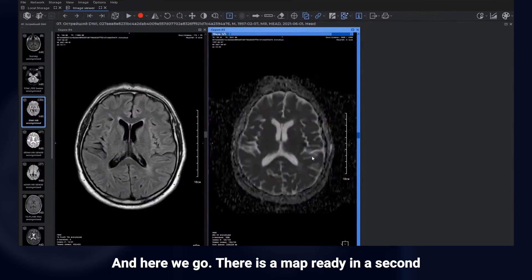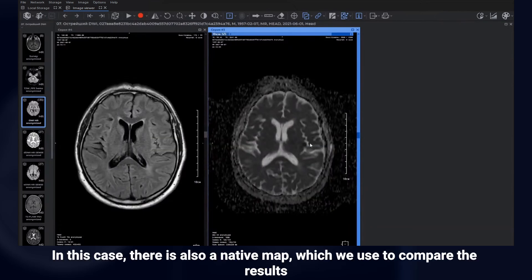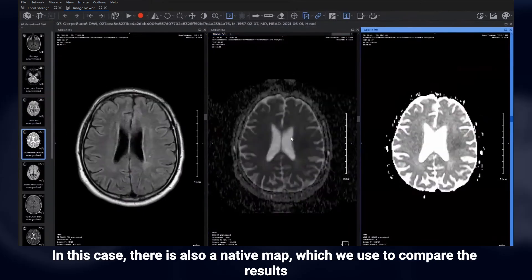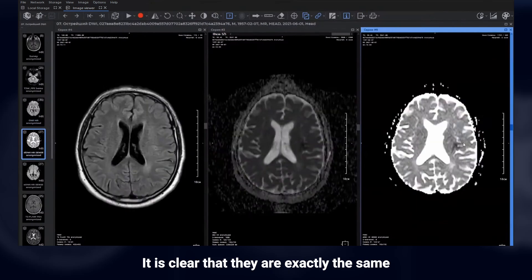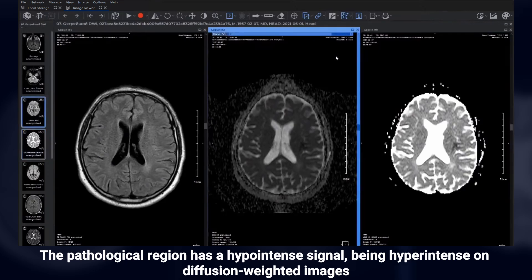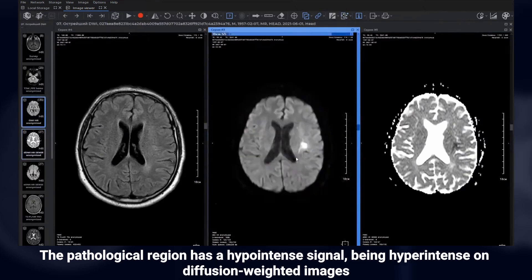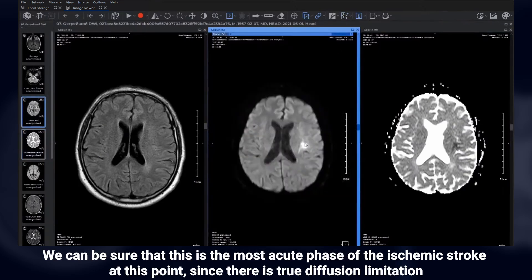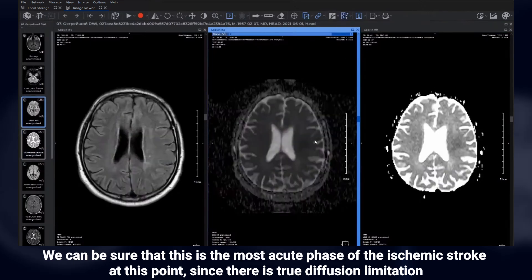And here we go — there is a map ready in a second. In this case, there is also a native map, which we use to compare the results. It is clear that they are exactly the same. The pathological region has a hypo-intense signal, being hyper-intense on diffusion-weighted images. We can be sure that this is the most acute phase of the ischemic stroke, since there is true diffusion limitation.